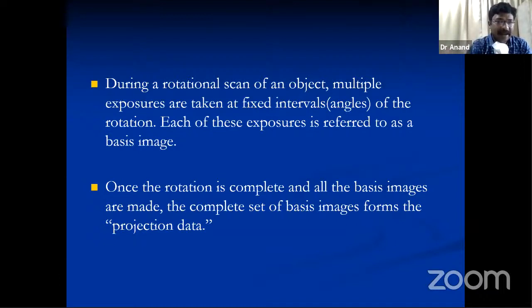So when you have a pulse, it falls over the patient and then falls over the detector. Once it gets an image, it is immediately transferred to the data storage so that the detector is cleared to capture the next images along the next rotational arc. When it rotates, it should capture the next lateral cephalometric image. For that, the previous data has to be cleared. That previous data is transferred to the data storage so that the next image can be obtained.